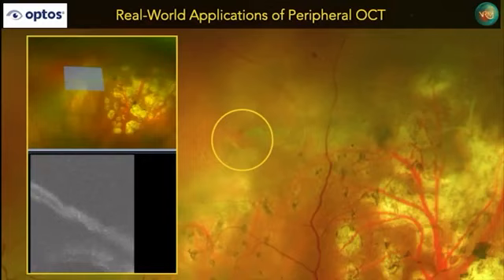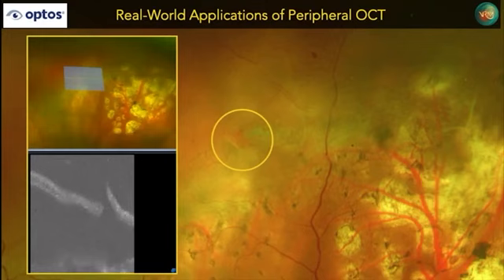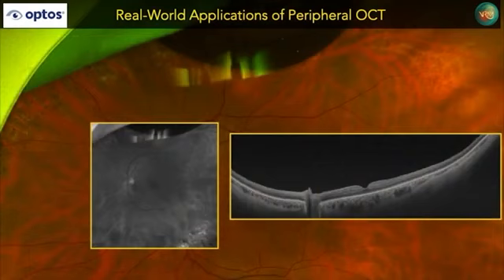She then subsequently underwent an in-office pneumatic retinopexy. Again, this is a vitrectomized eye. And this is her today, actually. So we had her one week post-procedure. Her retina's attached. She's 20/40. The break is healing. You can see the bubble up there. And ultimately, this was a time-saving and sight-saving event for her, and she was very appreciative. And it was all done with a little bit of handiwork in the office using the Silverstone.